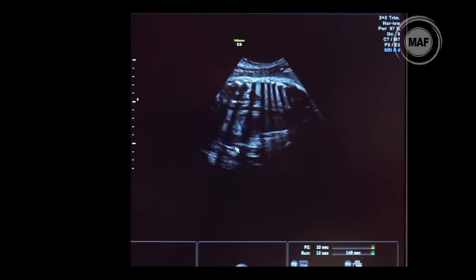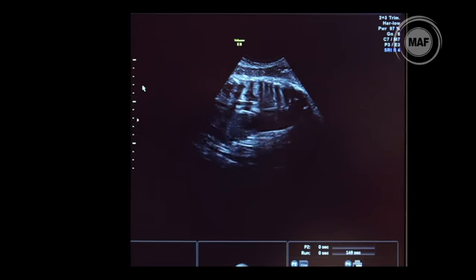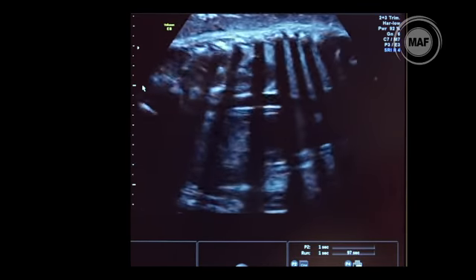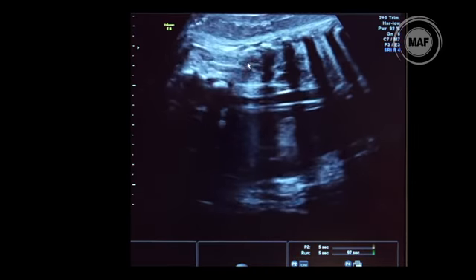Now observe what happens to the image as we change our focus. I'm going up. See the focus has gone up here? And see what happens to the image. I'll go up and down with that focus. Do you see that getting darker? Yeah. And then that's zooming in. Yeah. You can see the kidney there if you zoom in properly.